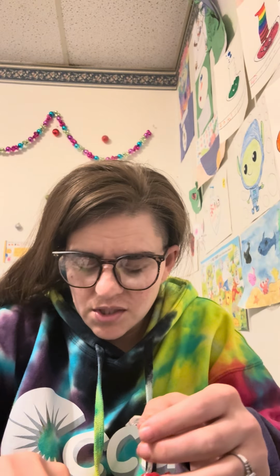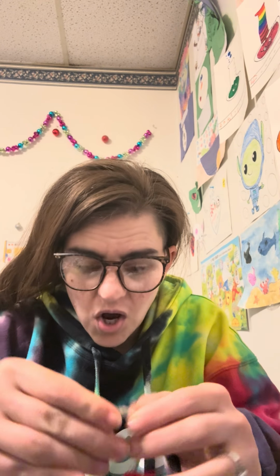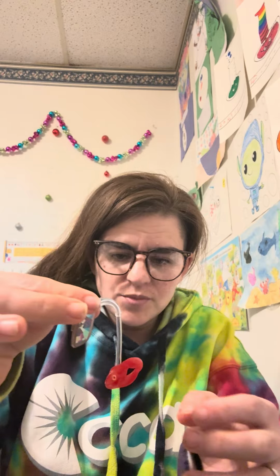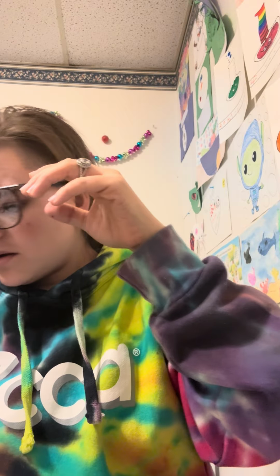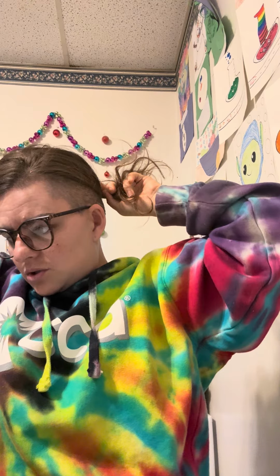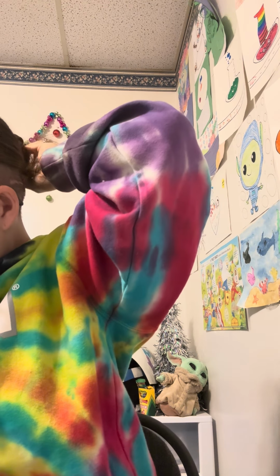So then you stick this back on and you stick it on your ear. Obviously, this is too long, but I'm just showing you as an example. So you stick it on your ear. Do I have a hair tie right here? I do not. I should have thought about a hair tie before making this video, but at any rate, this should be good enough. Anyway, excuse the hair, I'm tying it up just so you can see my ear.